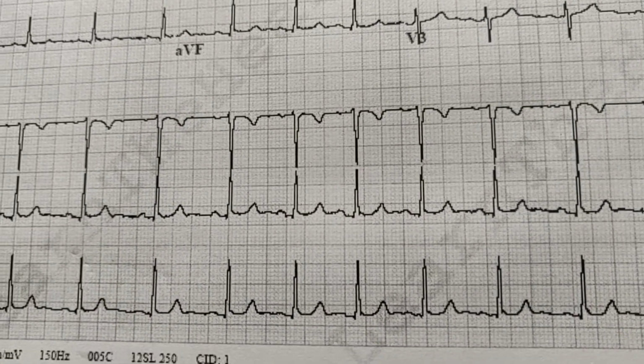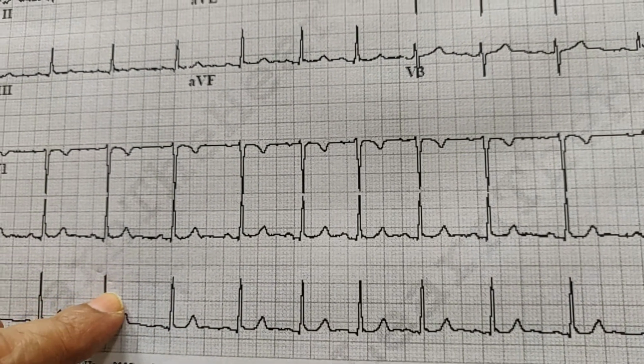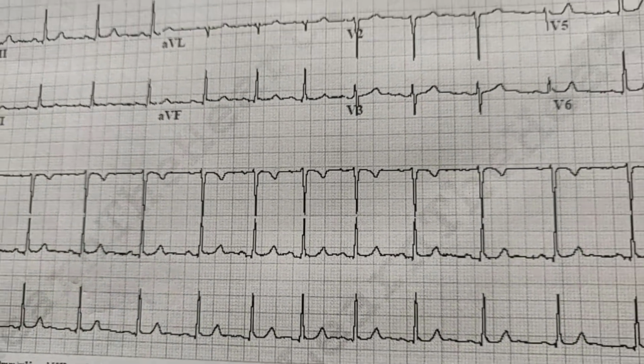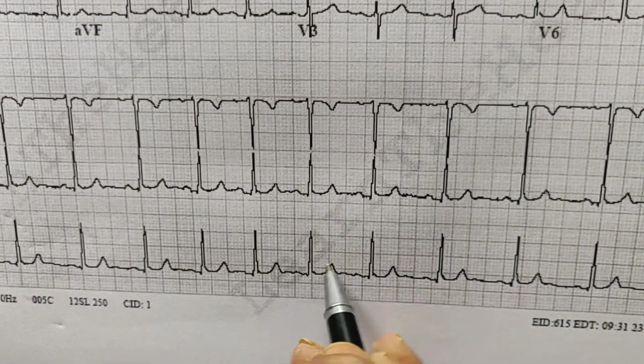Because I'm very comfortable in Hindi language as far as this type of calculation is concerned. Small boxes, this is 5, 10, 15 and 20. So 1500 divided by 20, again that will be 75 per minute, right? And you can calculate again by RR method also. So 1, 2, 3, 4, 5, 6, 7, 8, 9.